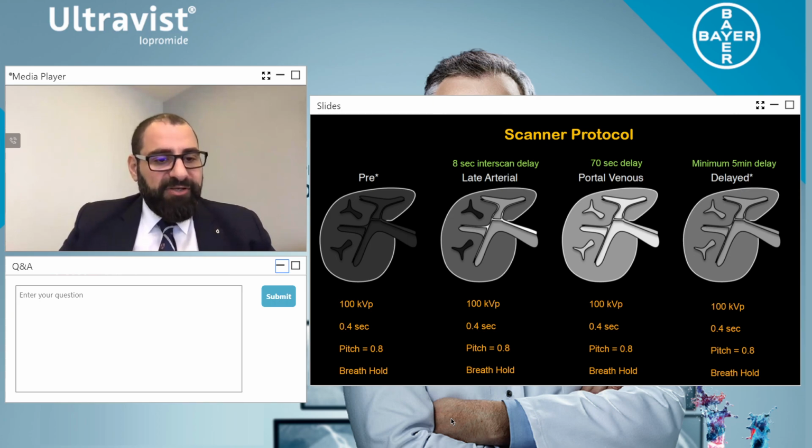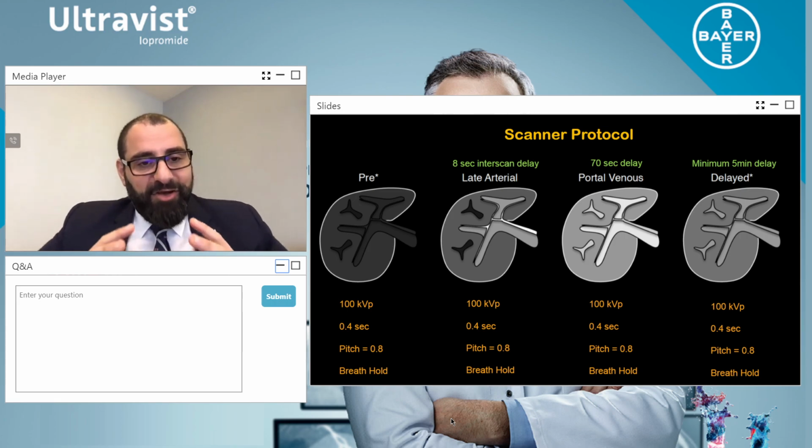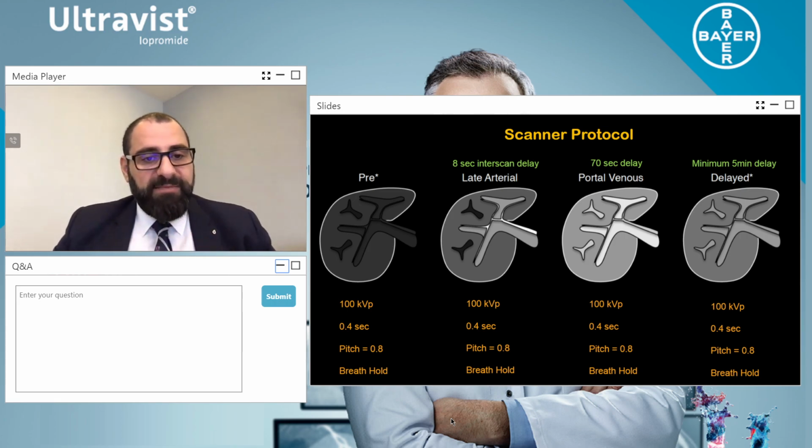Now, another question from Gokaran Prasad, thank you. How much contrast volume do you need for liver volumetry? Excellent. So I do a lot of liver volumetry for liver transplants or partial liver or hepatocellular carcinoma resections. So remember, the contrast volume should be a minimum of 80 mils, but more important, it's the 100 mils of saline. You want to distribute the contrast equally.